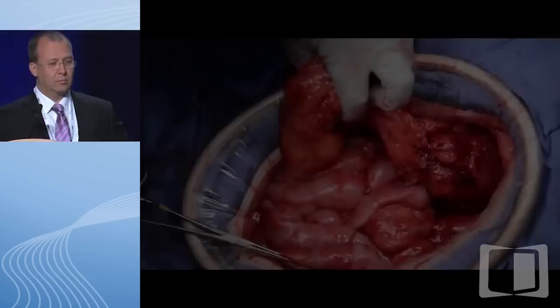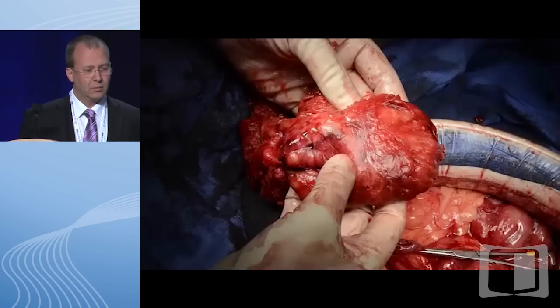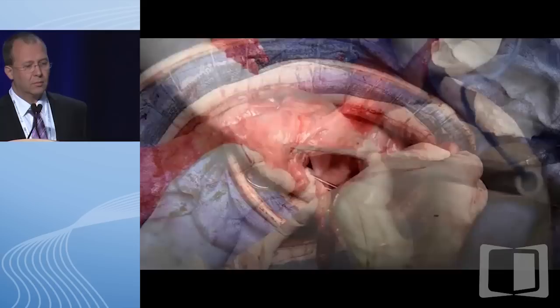At surgery, the ileoanal pouch was found to still be in position in the pelvis. However, unfortunately, it had been completely cut off from the small bowel mesentery during the division of the small bowel in his previous surgery. The pouch was excised from the pelvis, and the omentum, which was adherent to it, was divided.